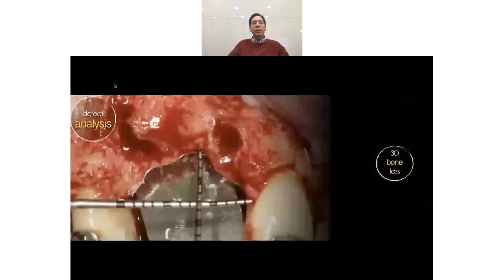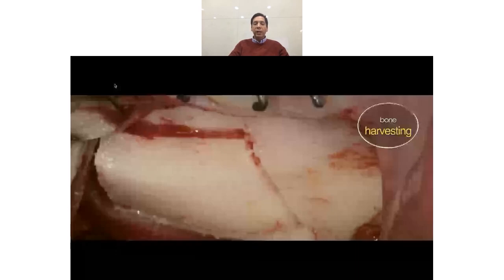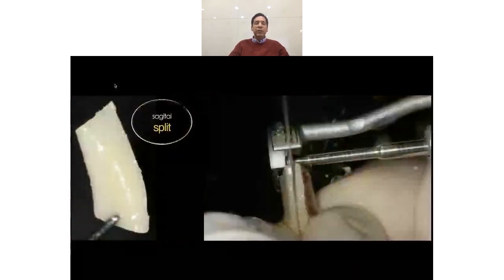We can see here that we have a 7 millimeter bone defect, a 7 millimeter vertical component. And we're gonna harvest the bone. So we raise a flap in the left side of the mandible, and we took a block from there. And we also went to the right side of the mandible and we took another block. Then we split the block sagittally.